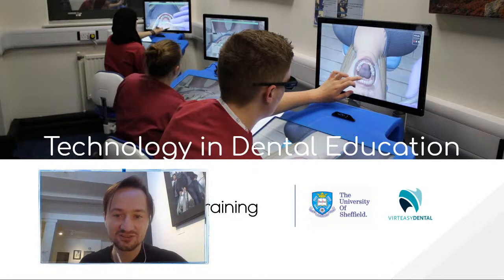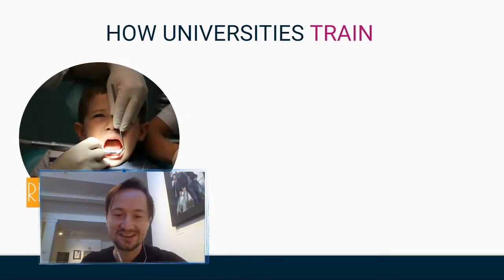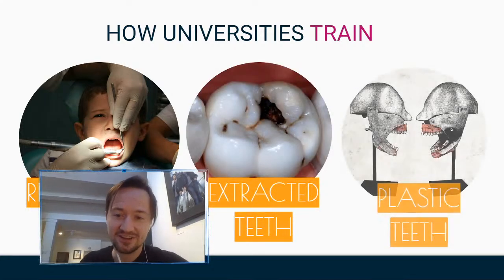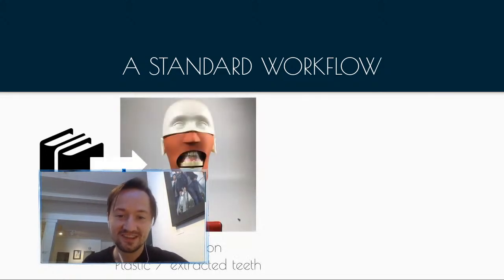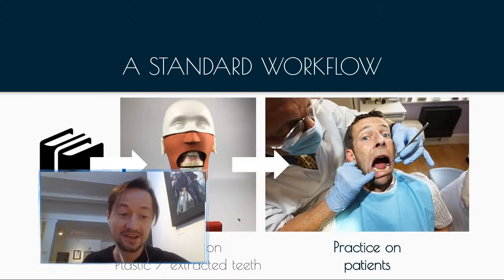And so we're looking at technology in dental education. And you know as well as I do that at the moment universities train using real patients and extracted teeth. Now these might be real extracted teeth, or we use plastic teeth in the phantom heads as well. Now obviously this poses a few problems normally. And if we look at the standard workflow, students might just be learning the theory for the first year, going over to the phantom heads, and then over to their first real patients.